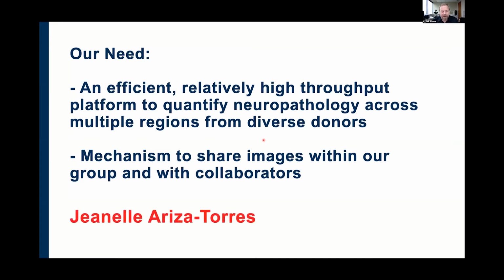And so with that, I asked Jeanelle from our lab to start to investigate. And she's done, as you'll see, a really deep dive into the different options and settled on Halo for our group, which really meets these needs, I think, perfectly. So with that, I'm going to turn it over to Jeanelle, and she can give an overview of Halo, and we can answer any questions that people have as we go over at the end.